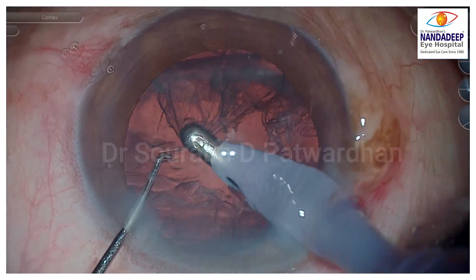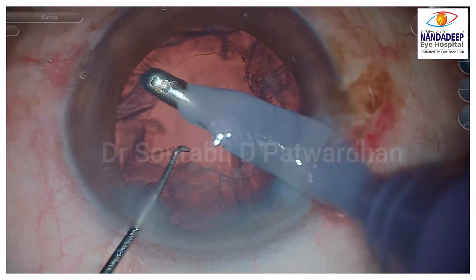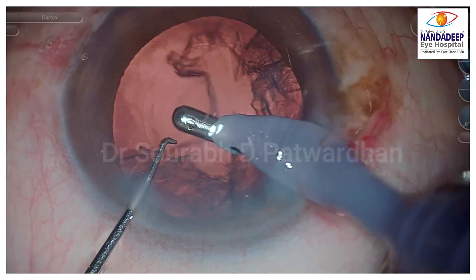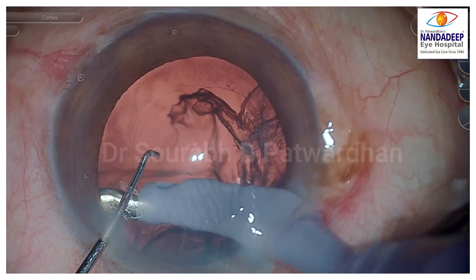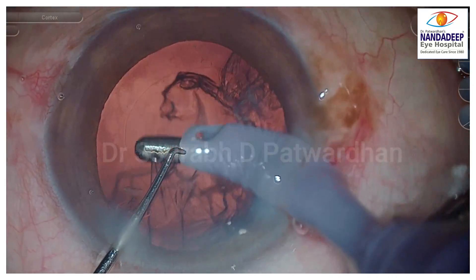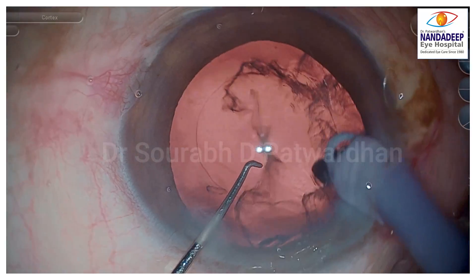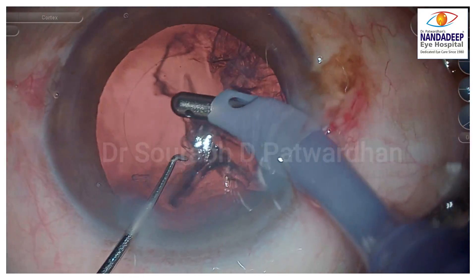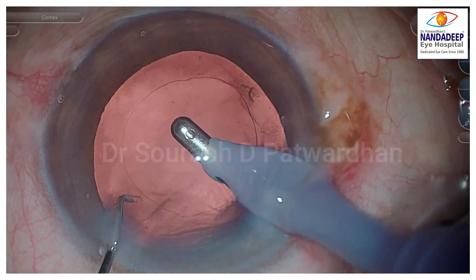Now for sub-incisional cortex removal — just watch as I remove the cortex. It's the sideways motion when I grab hold of the cortex which makes it easier to remove, rather than just centripetal pulling. Learn that sideways movement of the I&A tip. For sub-incisional cortex, watch that I am consciously keeping the irrigation always inside — I do not withdraw the tip.